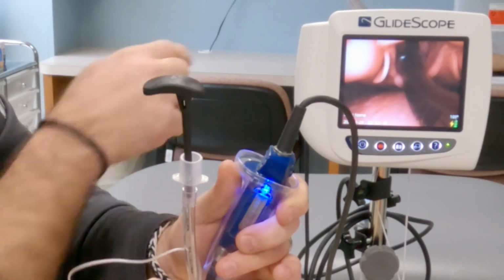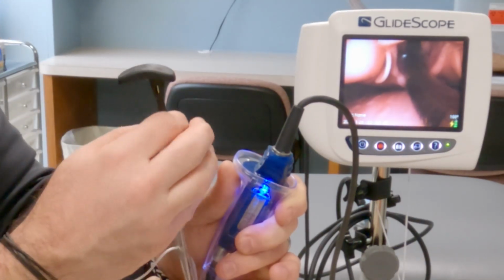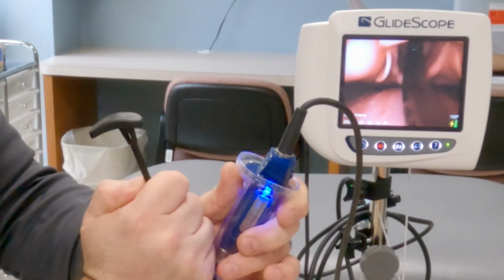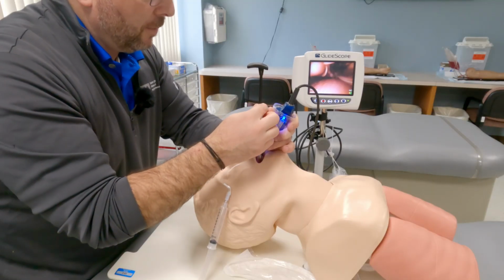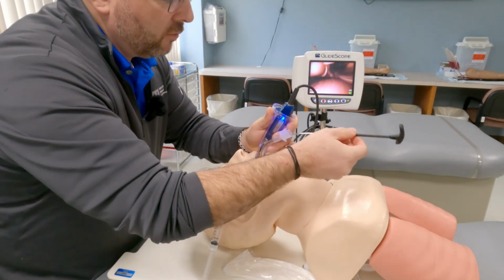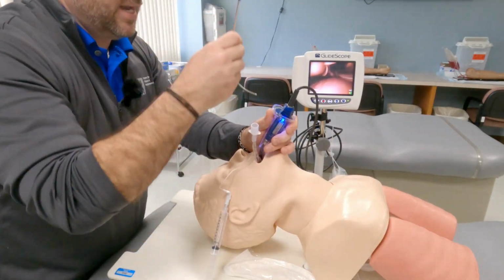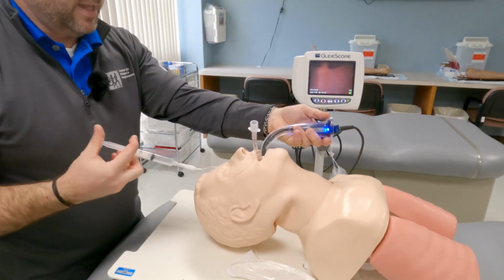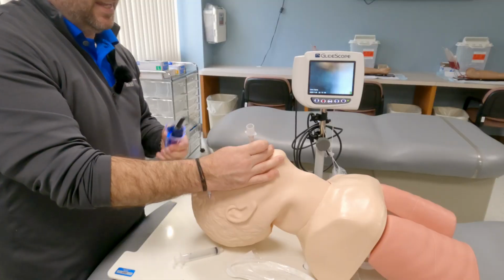You can see right there on that monitor the end of that rigid stylet coming up, and it makes the end of the tube very flimsy and allows it to go in. So sometimes they'll pop up and push in a little bit. Now I'm ready to remove. Remove out. Go towards the chest when I remove out. Don't go straight up because it's rigid. Out towards the chest. Inflate and ventilate. And so that's the key.